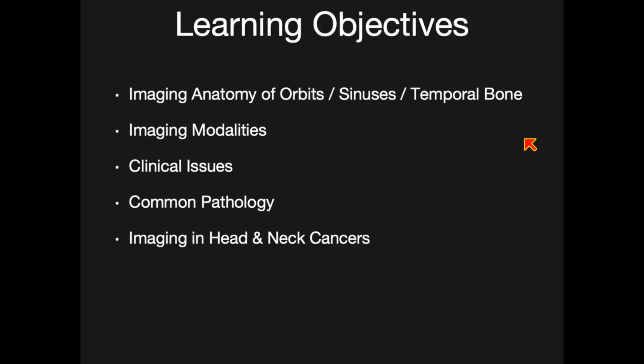Review some clinical conditions and how the clinical issues guide us towards appropriate imaging. Some common pathology, and end this talk by imaging of the head and neck cancers.